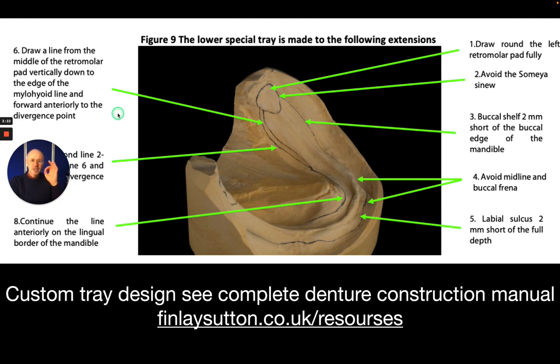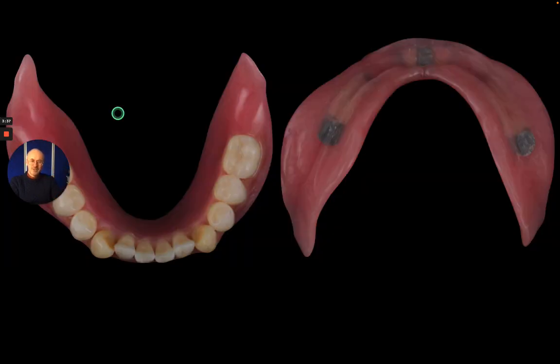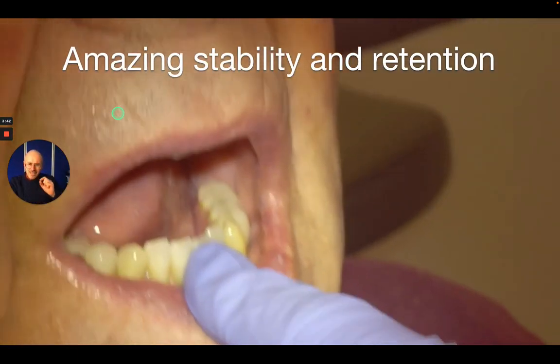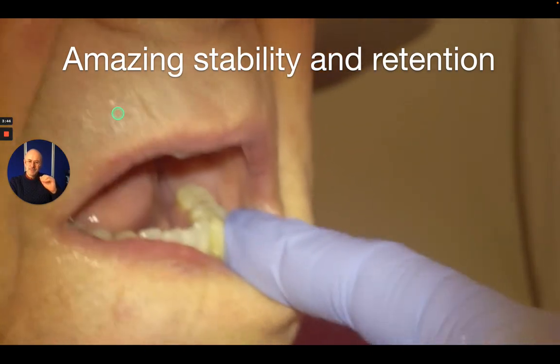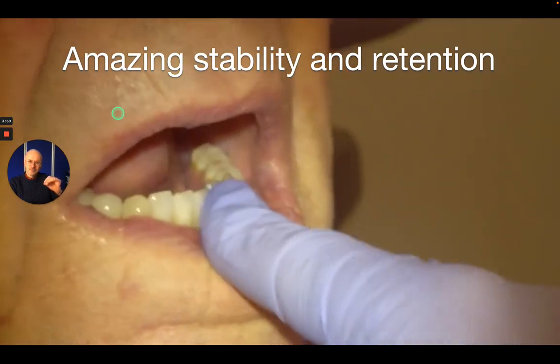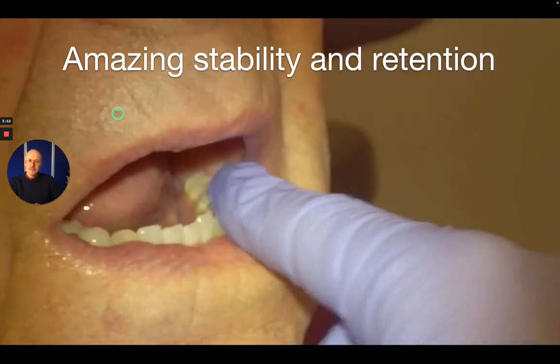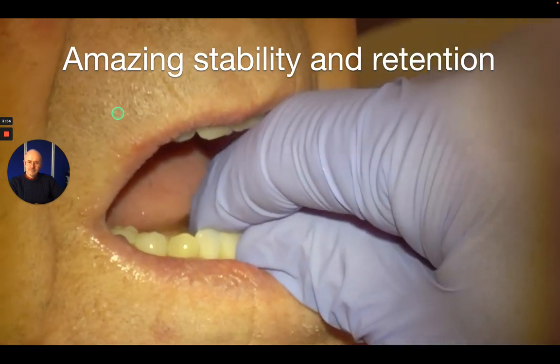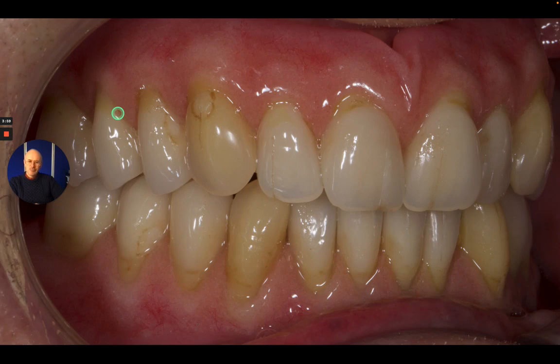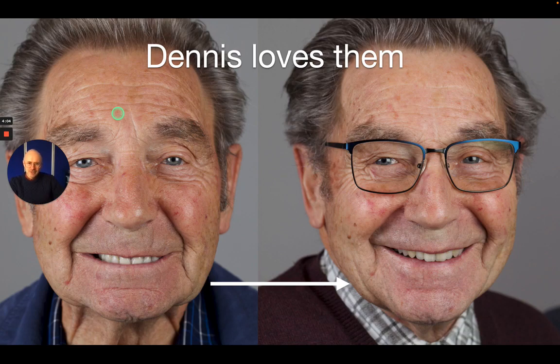From that I then do a working impression using that special tray to produce the denture, and then that denture has maximum stability and also suction if we can generate that too. If we combine that with some lovely-looking denture teeth, the patient can be very nicely restored. Thanks very much.